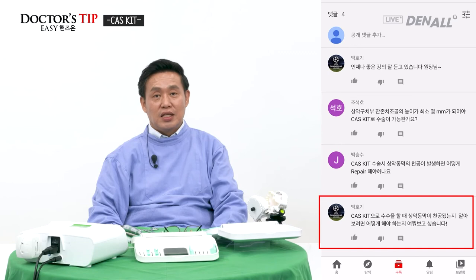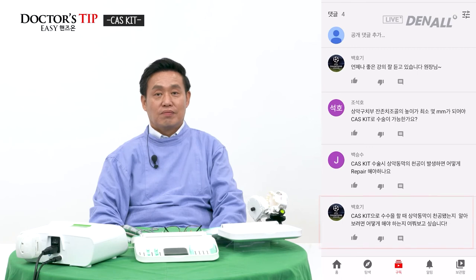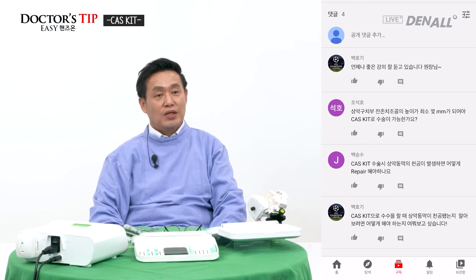That means short implants can be placed, or lateral approach forming a window can be used to see the perforation directly with your eyes and do some repair and continue with the surgery. If you cannot do this lateral approach, you should stop the surgery and you need to wait 3 or 4 months to try it again. I don't know whether that answers your question. The next question.